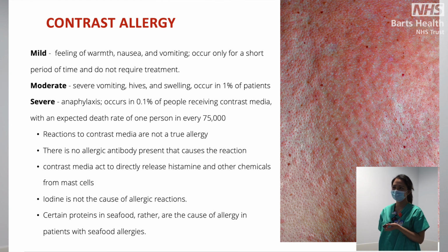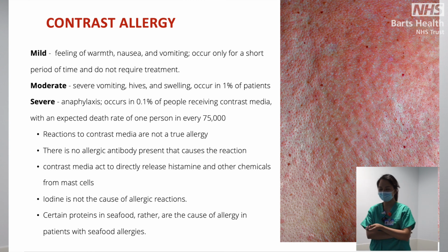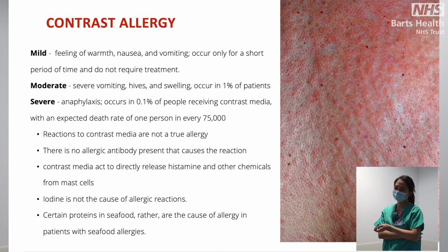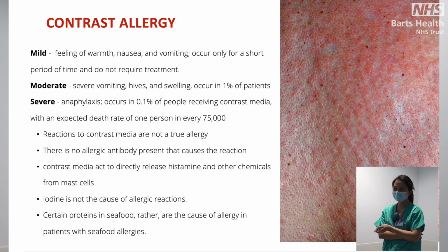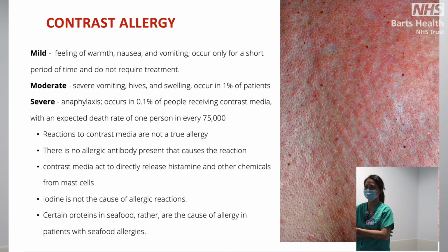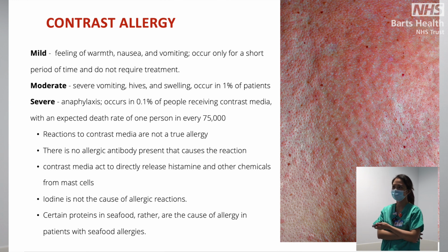So reactions to contrast media are not a true allergy because there is no allergic antibody present that causes the reaction. Contrast media act to directly release histamine and other chemicals from mast cells. So seafood allergies or iodine allergies are not really the cause. Studies show that there are certain proteins in the seafood rather than the iodine that make the person allergic to seafood. Anyway, we have a protocol here in the department that we give hydrocortisone if they are allergic to iodine and seafood, just for precaution.